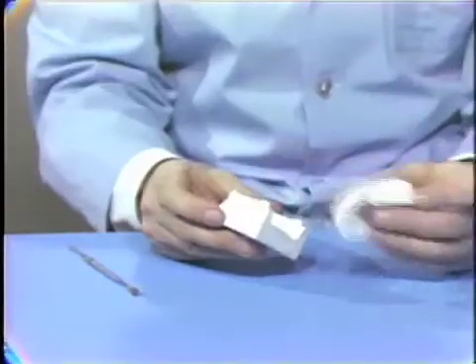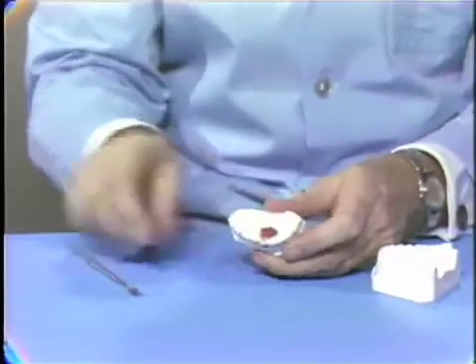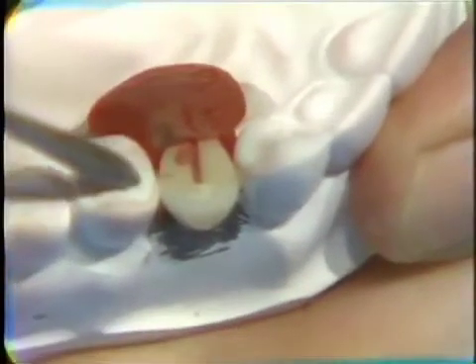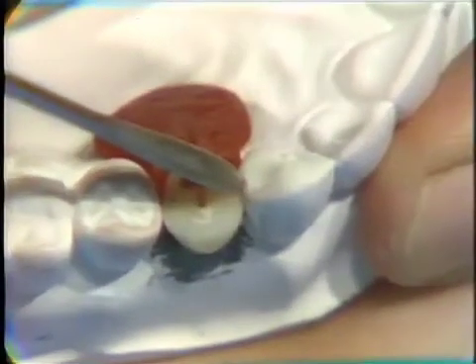And you can check this too. Again, I think if we take a close look at the pontic facing in here, the other thing to do is to examine particularly carefully the sort of step down between the marginal ridge of the adjacent tooth here and the top of the porcelain pontic. In there, remember, you've got to get your connector and the gold surface between the two, the solder joint there and on this side. And when this is against a cuspid, which is with its low lingual cusp, it's often a little difficult to get a good relationship in there.